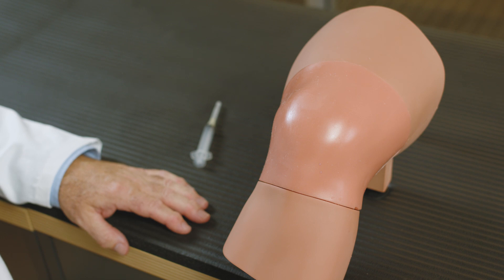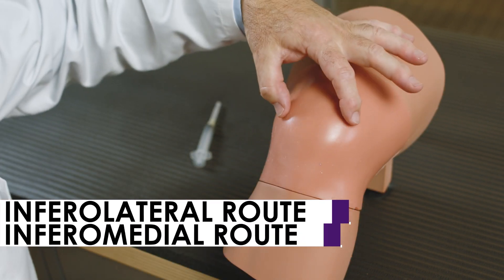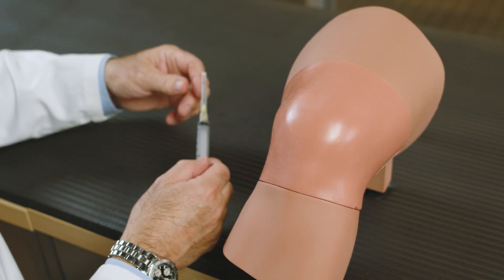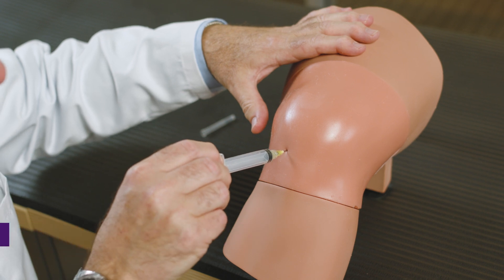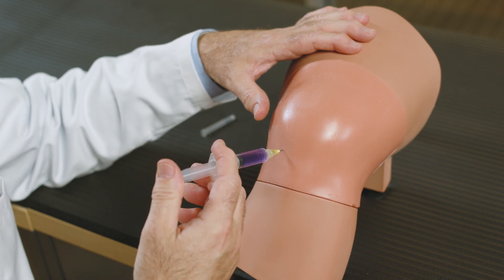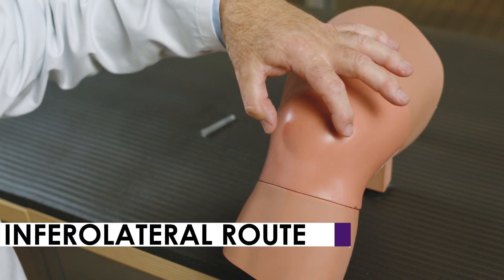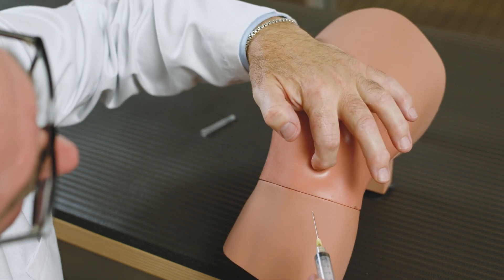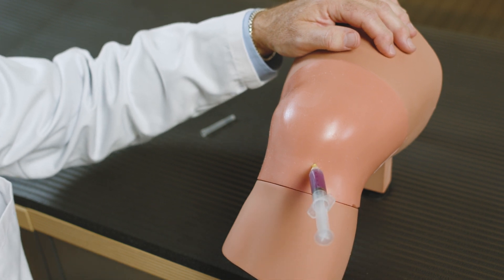Firstly we're going to demonstrate with the patient sitting on the edge of the examination table the inferolateral route and the inferomedial route of injection. So again we identify the patella and the patellar tendon and the joint line on either side of that, and then we mark our position for the inferomedial route, insert the needle, and we're going to draw back fluid from the knee joint. For the inferolateral route we do the same — identify the patella, patellar tendon, the joint line, mark our position for the needle, and then introduce the needle into the joint and draw back to make sure that we're in the joint space before we do the injection.